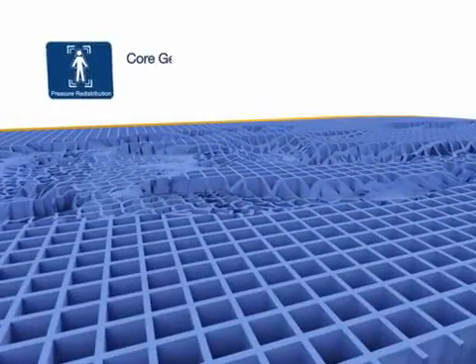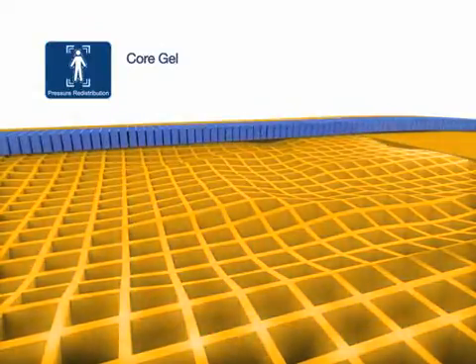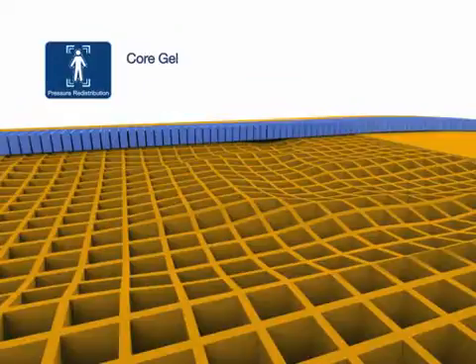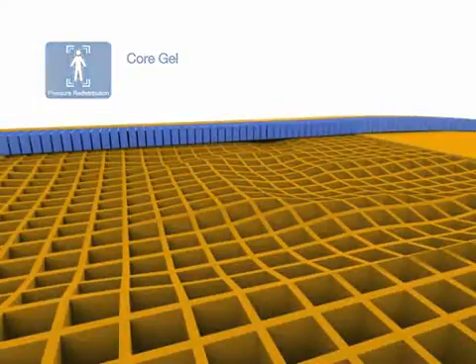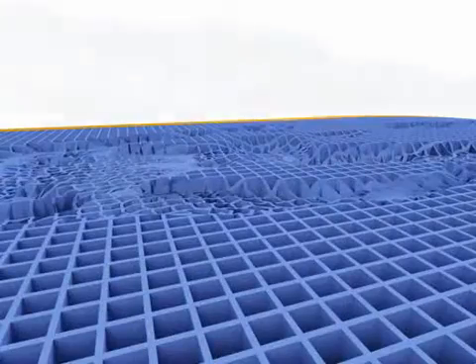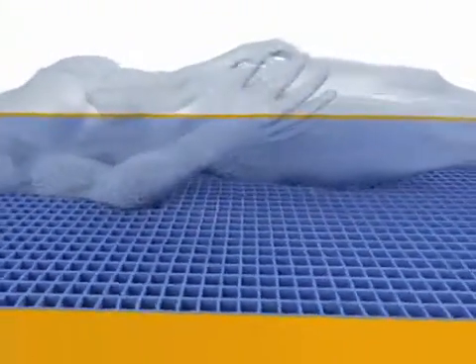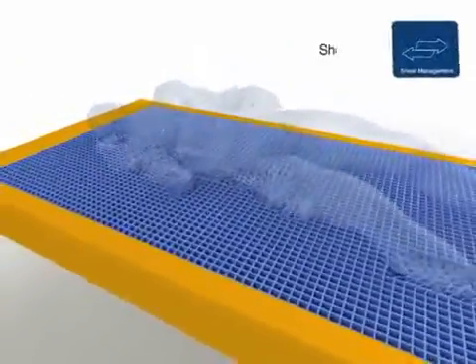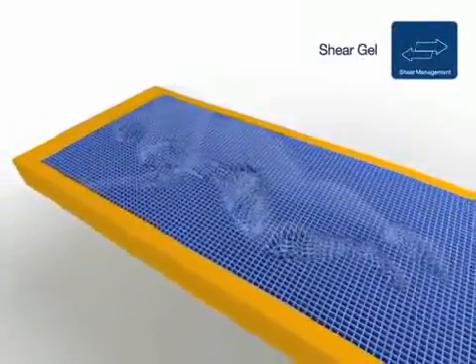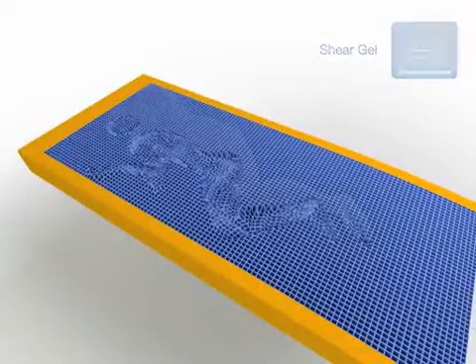CoreGel is designed to redistribute pressure in the sacral region, where the highest percentage of pressure ulcers occur. The CoreGel layer redistributes pressure by buckling and absorbing the patient's weight, allowing immersion and envelopment to take place. Shear gel moves freely with the patient to help minimize shear forces at the interface between the surface and the patient.